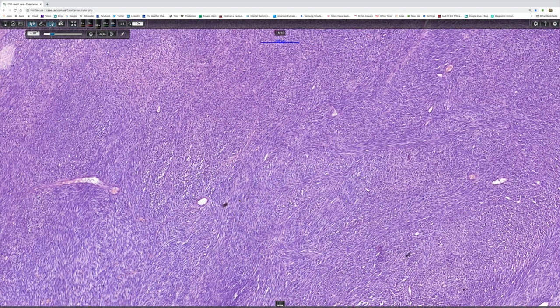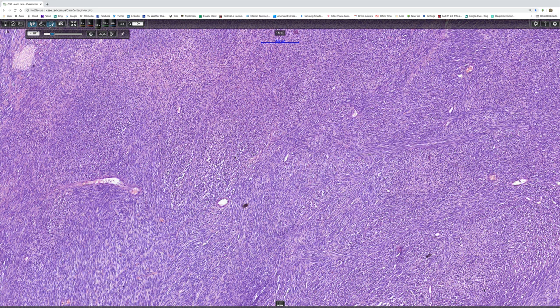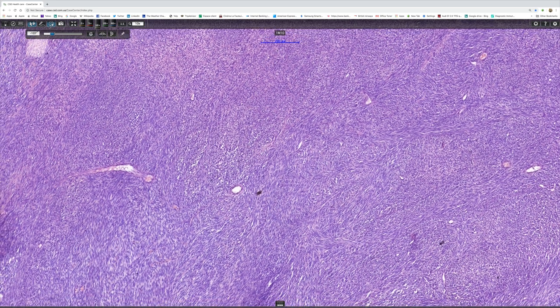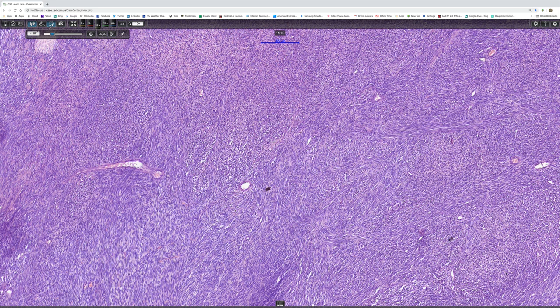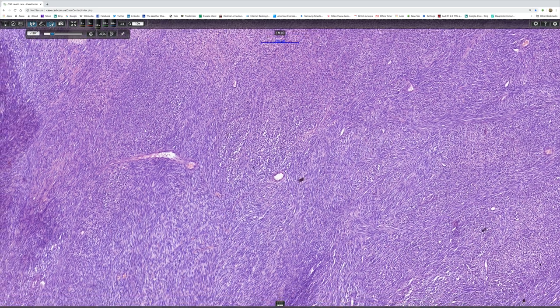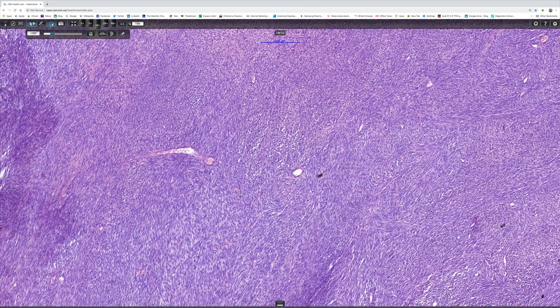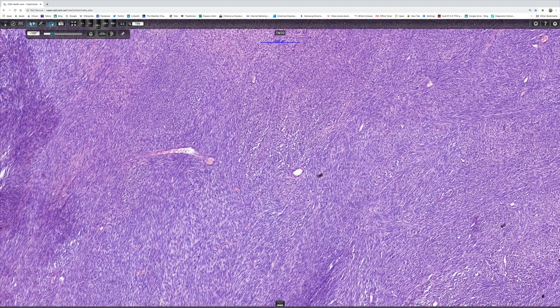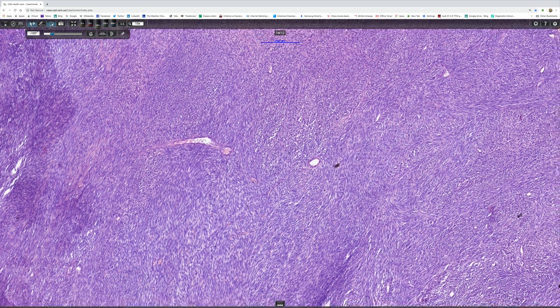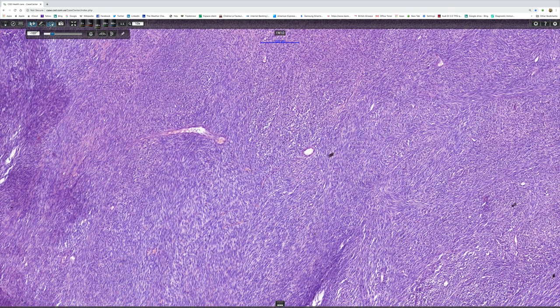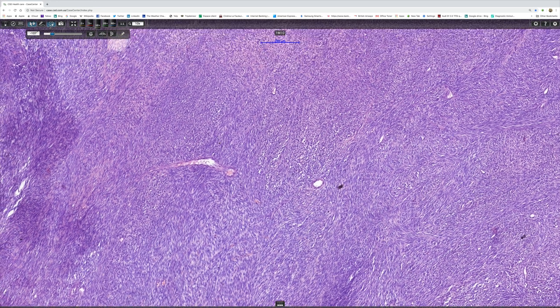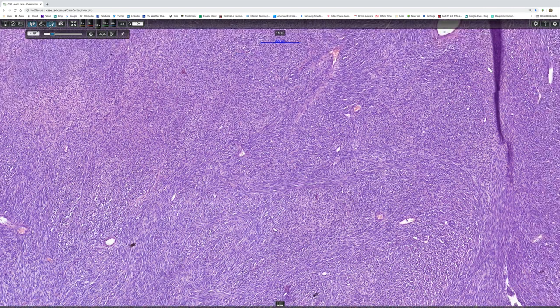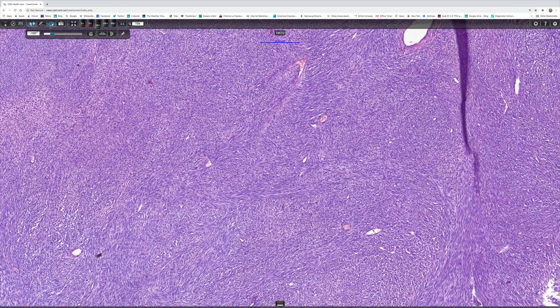But what other tumors might look like it? Well, malignant peripheral nerve sheath tumor would be a very good differential. Fibrosarcoma arising in a background of dermatofibrosarcoma protuberans would be another possibility. You might think of leiomyosarcoma, although the basophilia of the cytoplasm would be against that. And as a last resort you might end up calling it a fibrosarcoma.